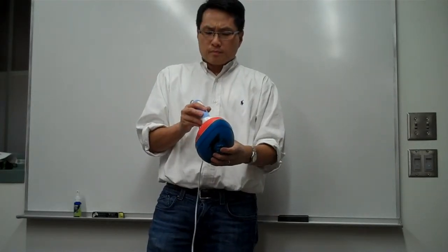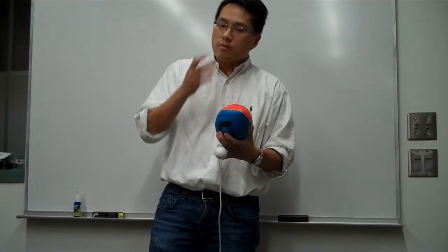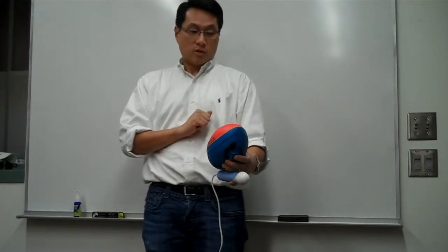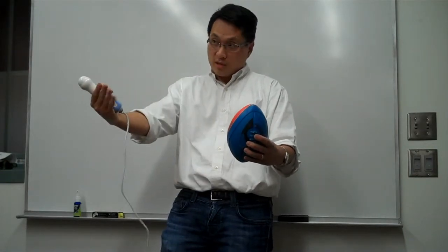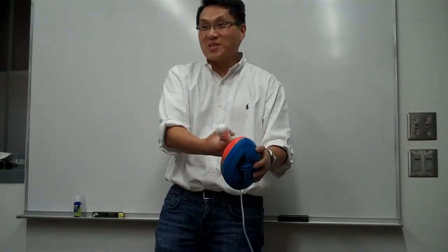So basically the simulator, what I'm thinking is that because you don't know what's going on, now we can see it. We see this is the position, we have the probe this way, and we know what the image is going to be. In real life, you don't know what the baby is doing. That's why you get an ultrasound, right?